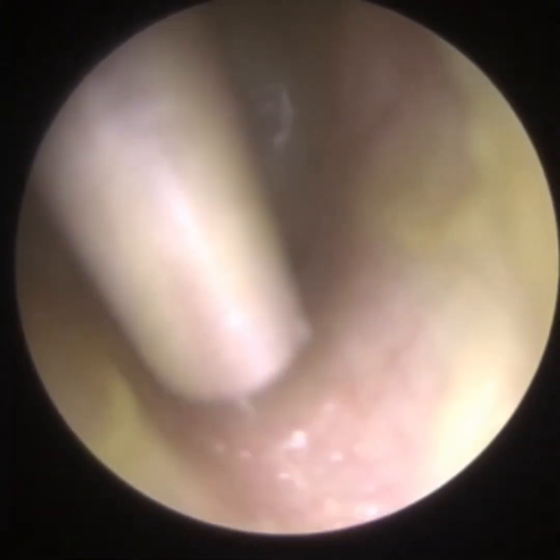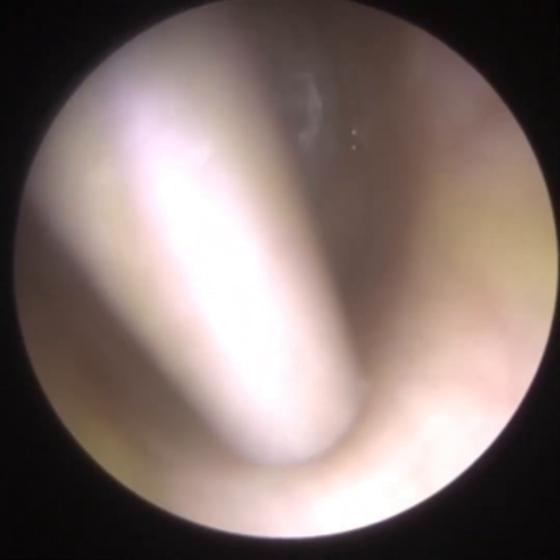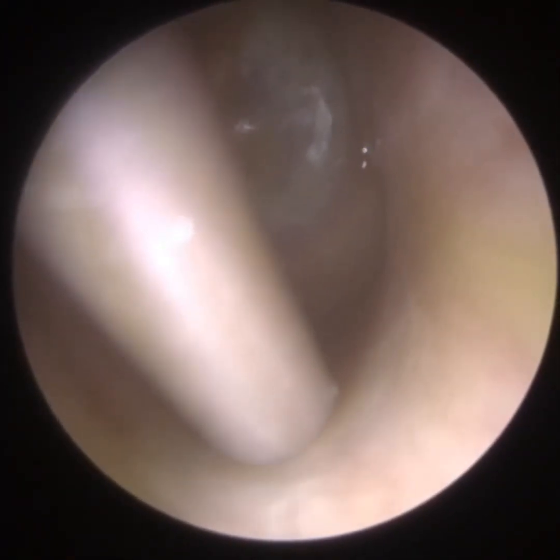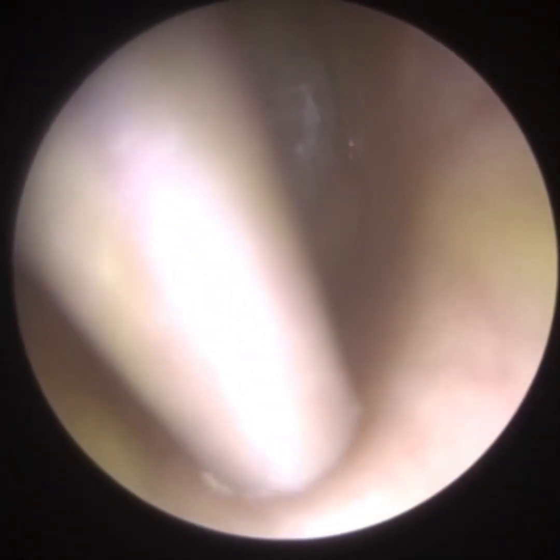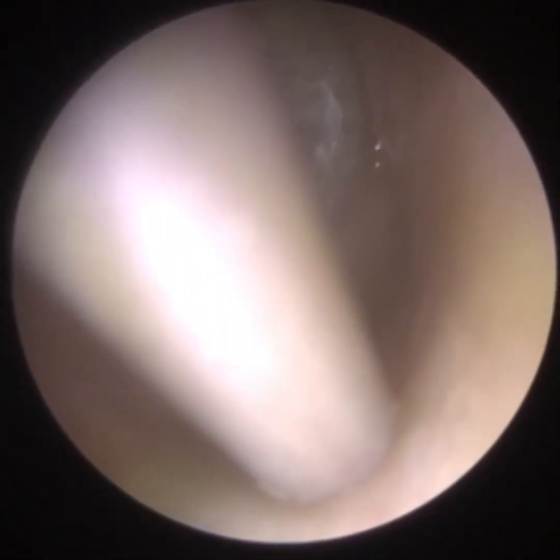I was trying to fathom where this discharge was coming from. I'm just using microsuction initially — I cleared the entrance of the ear canal where the majority of this discharge was. You can see I'm now going deeper and deeper into the ear canal, using a fine-gauge end, just gently suctioning all this discharge — otorrhoea — following the trail to see where it's coming from.